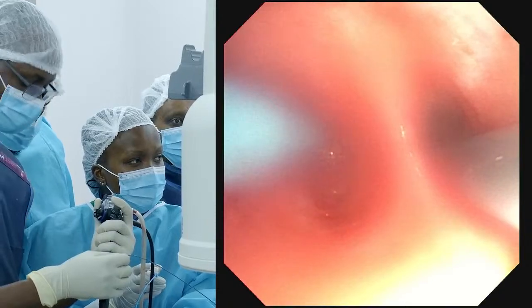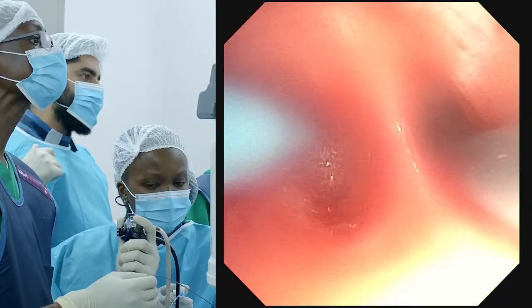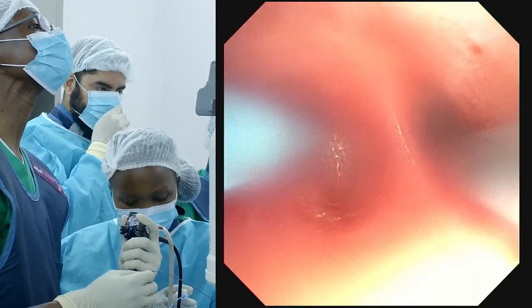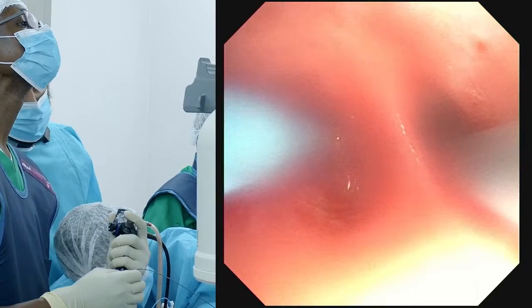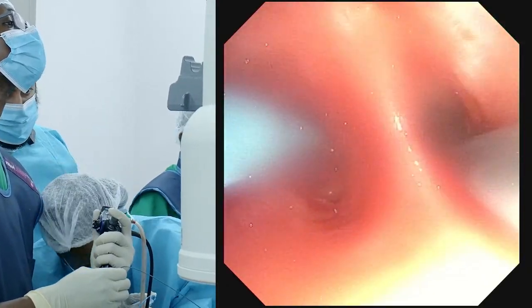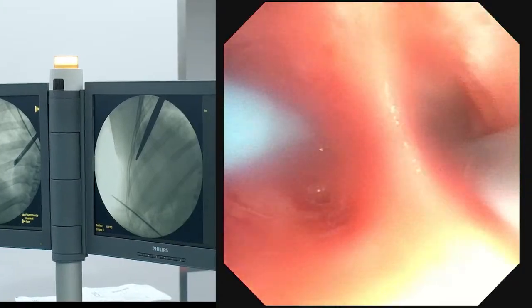Okay. All right. So continue. Step on the pedal. Good. Now you can see where the tip is. Now what I want you to do is, can you feel resistance? Yeah, it's already. Now pull back 2 centimeters. Okay, good. Not yeah, but just 2 centimeters. Good.